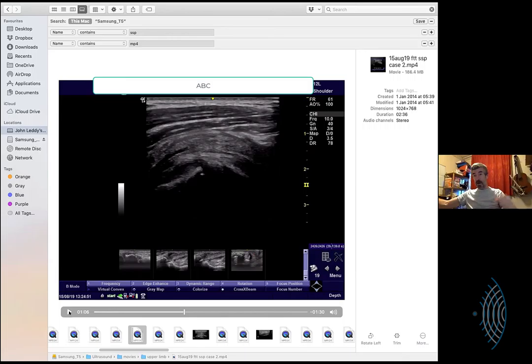Yes. Okay. And you used a towel here to indicate what you would use when you were in the... I'm with you. All right. Yeah. A long piece of thick string. Brilliant. You stick it on the probe, and so long as you remember that the greater tuberosity sits in exactly the same orientation as your lateral epicondyle on a patient.